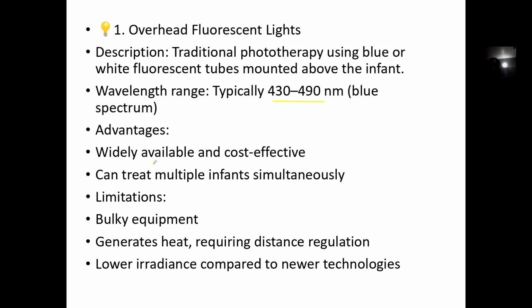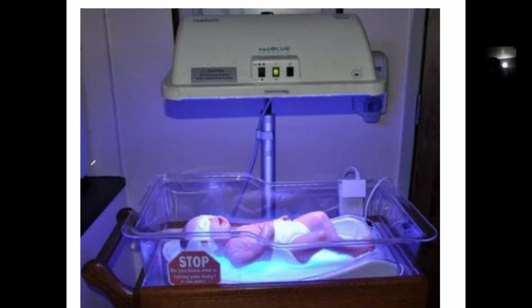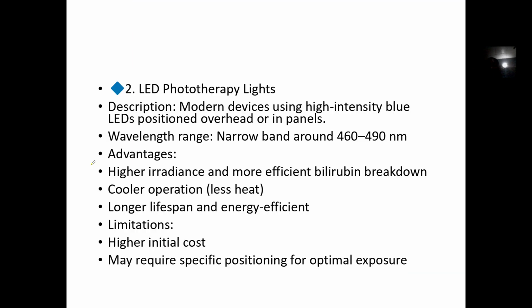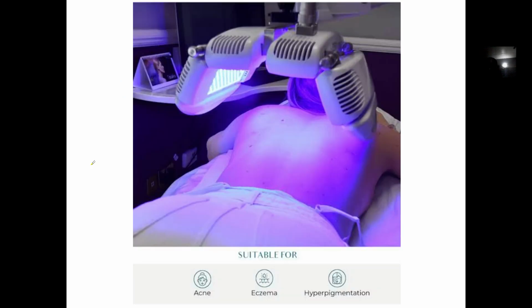Advantages: it is widely available. You commonly see it in almost every facility. They can treat multiple infants at once, if the space is big enough to keep two babies. They actually generate heat. That's a disadvantage.